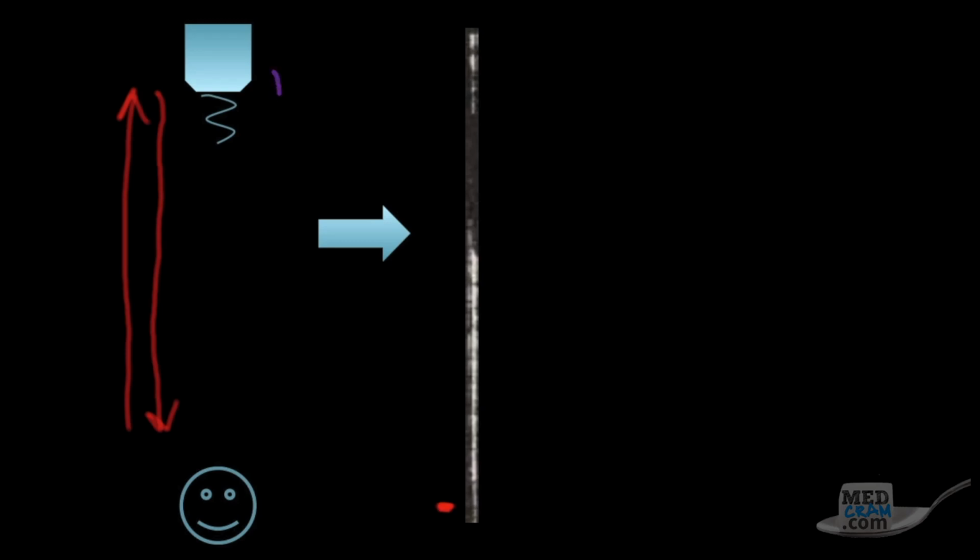Conversely, the more shallow that the ultrasound wave must penetrate and reflect back, the less time it takes to return, and therefore the ultrasound machine knows to place that more shallow on the scan line. The second component that you'll notice is the brightness. Think of the brightness as the volume of the returning echo, if you will, or the intensity of the returning echo. The louder the returning echo, the brighter it will appear. The quieter the returning echo, the less bright it will appear. So a more intense returning echo will appear brighter, and a less intense returning echo will appear darker.